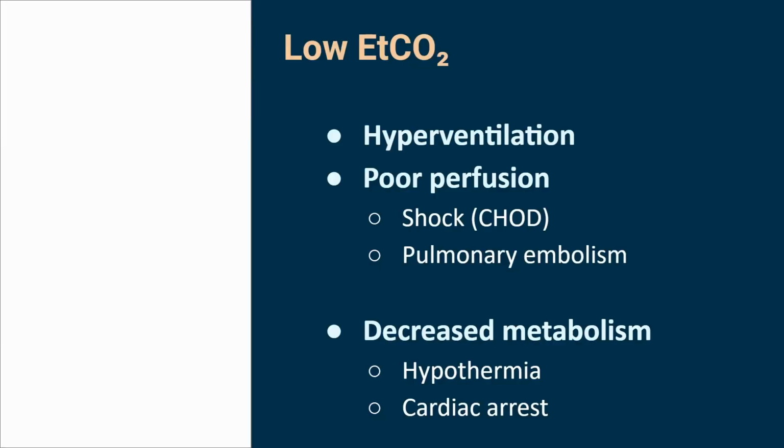As much as hypoventilation causes an increase in end tidal, this is the way I always kind of looked at it. You take a Coca-Cola can. It's got CO2 in it, right? If I pour that can out faster and faster, is there more CO2 in the can or less? Less. It's full with, engine degreaser and CO2, right? If I pour out a little bit of Coca-Cola, is there less CO2 in the can? Which means every pour, less CO2, right?